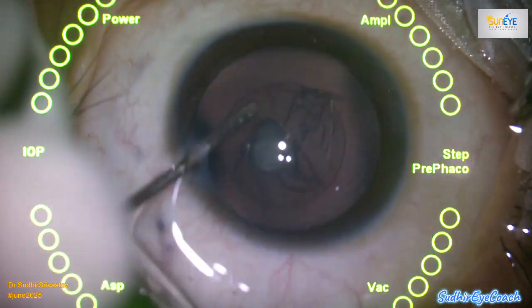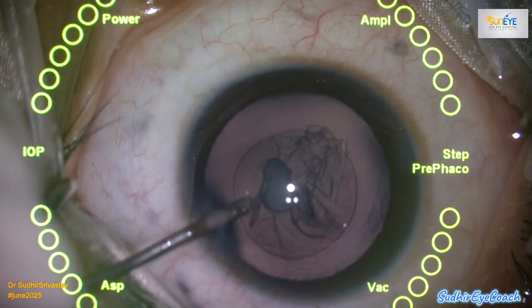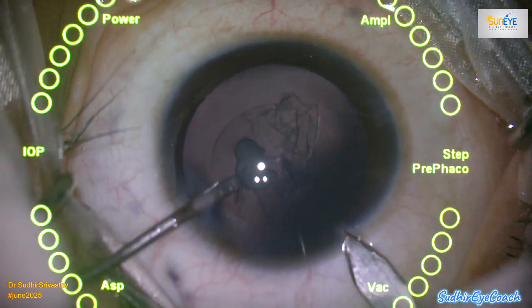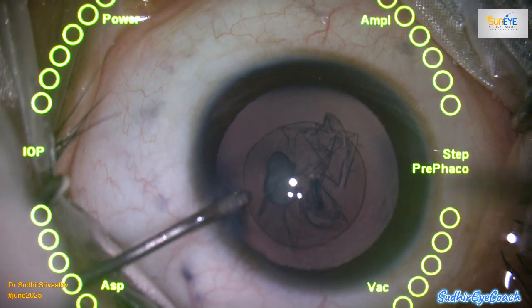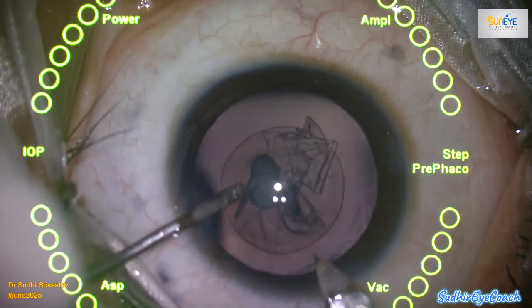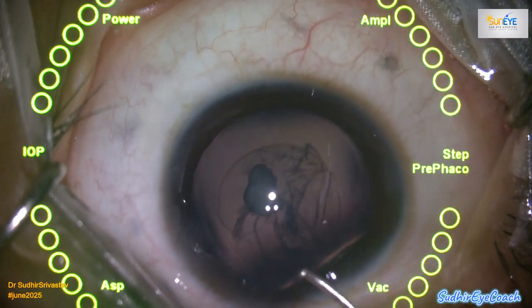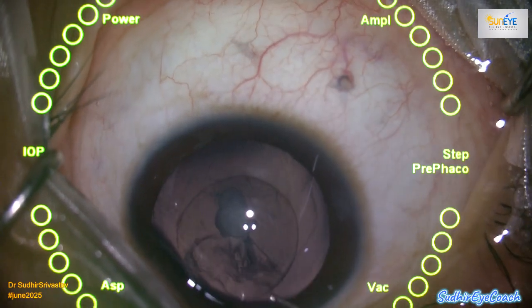In this particular case, since the patient was young and the cataract was soft with almost no nucleus, lens aspiration was quite straightforward. However, there was a plaque on the posterior capsule which required careful polishing. This is the time when you have to be very cautious, and often we can leave the plaque if it is quite adherent to the posterior capsule, but here it was lifted, and I thought that we could remove it easily with the fluid.